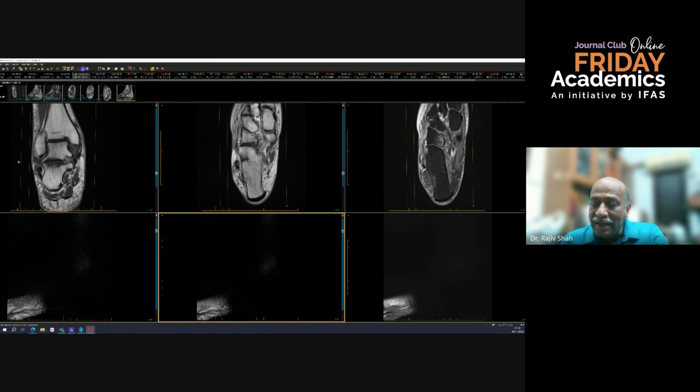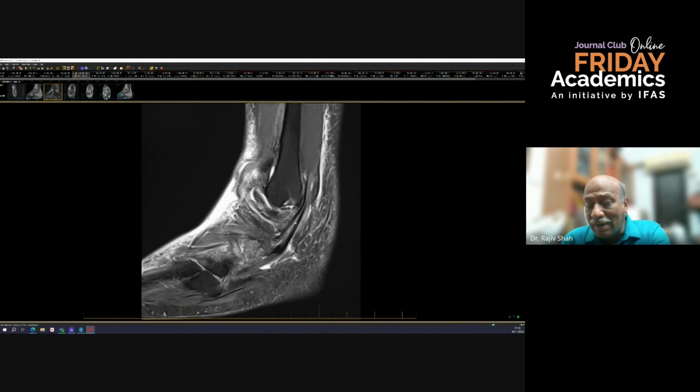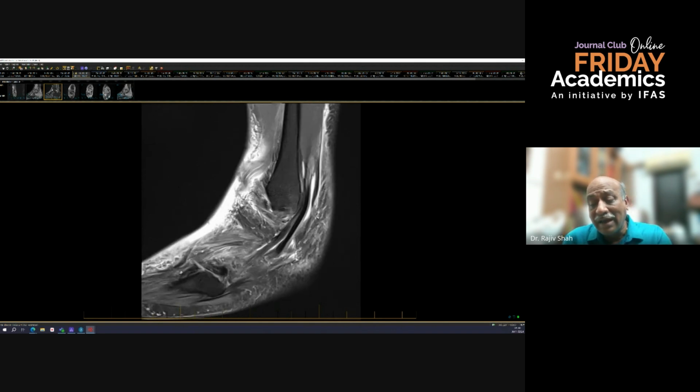And second, wherever a tendon turns around the bone acutely, what you see in MRI is something called the magic angle effect. This will not show a tear of a tendon in the MR, and that's where you might have to go to a dynamic ultrasonography, where you can invert, evert, dorsiflex, and plantarflex, and look at this kind of tear. So not to get surprises. These were two points.